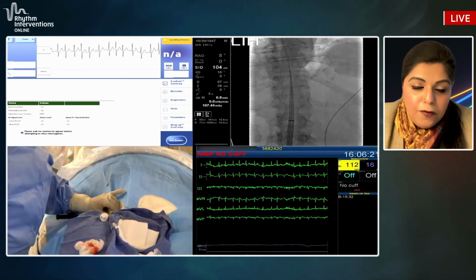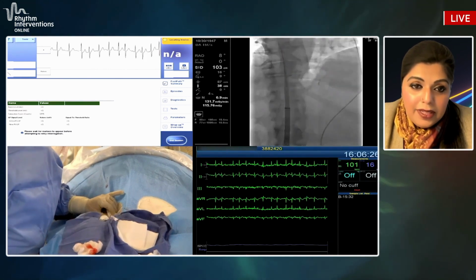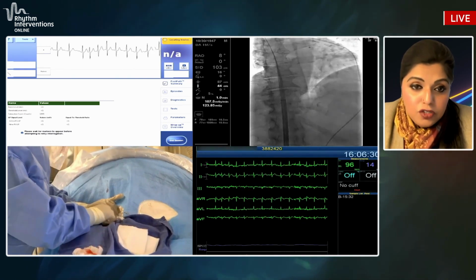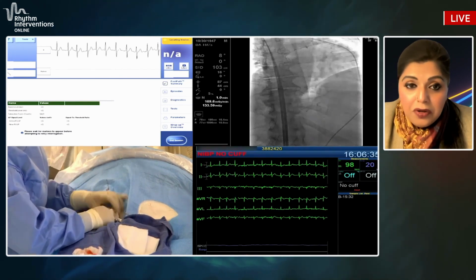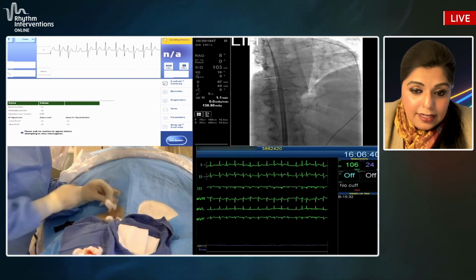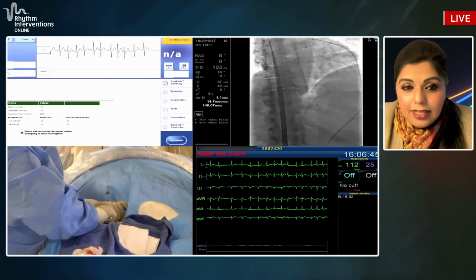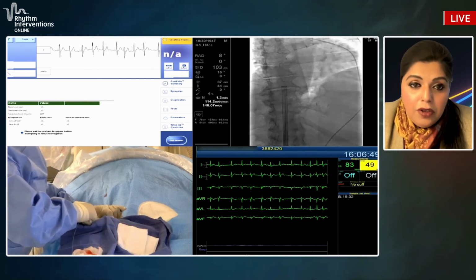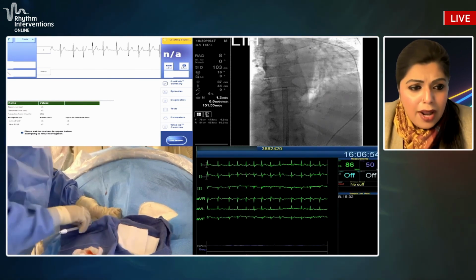But you can see we have a little bit of scoliosis here, and I'm being very careful as I go up with that sheath. These sheaths are relatively stiff, whether it's a micro sheath or an Avera sheath, so you have to be extremely cautious as you move up, avoiding any kinks in the wire and such. And you can see there's a radiopaque marker at the end of the introducer sheath, and what I'm trying to do is get that introducer sheath to the IVC-RA junction. I don't need to go any further. I'll stop there. I'm taking the dilator and the wire out.